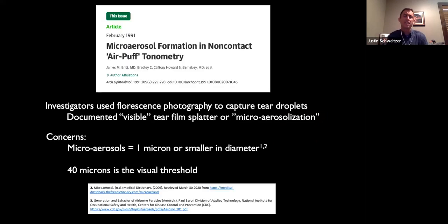So that leads me into talking real briefly about non-contact air puff tonometry in the world that we live in today, with the fears that, are we spreading COVID-19 by doing non-contact air tonometry? And if you do a literature search, there is really nothing out there that's published except for this particular study in February 1991. There's a lot of stuff out there right now saying that, yes, it can spread. I am of the belief right now that there's not enough data to say one way or the other. So I'm not sitting here saying it does spread by doing air puff tonometry or it doesn't.